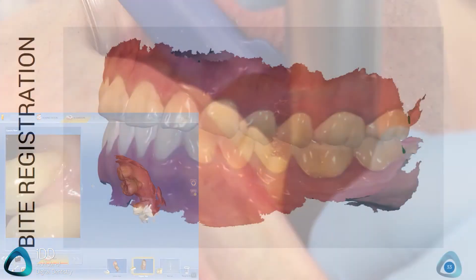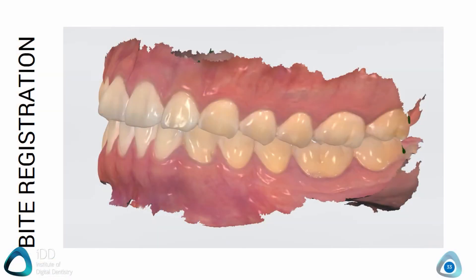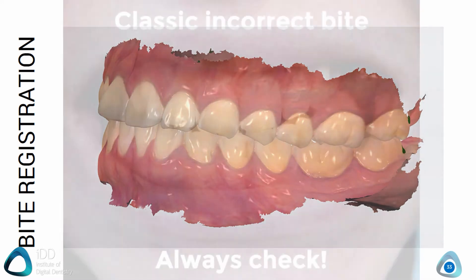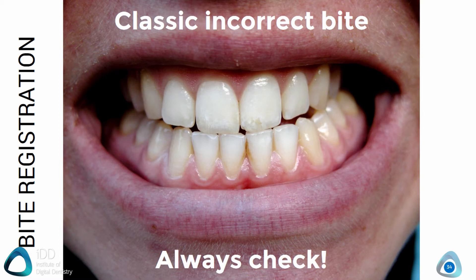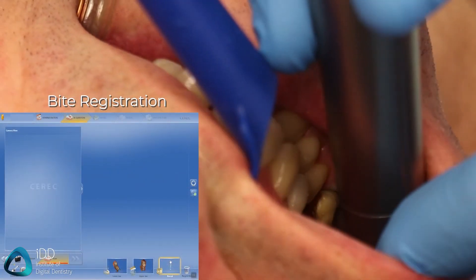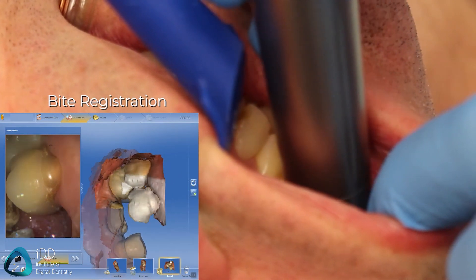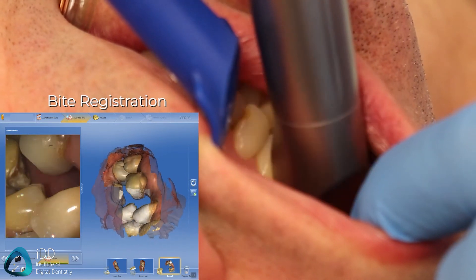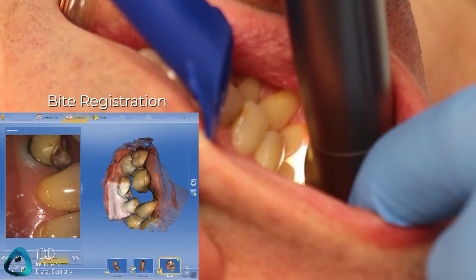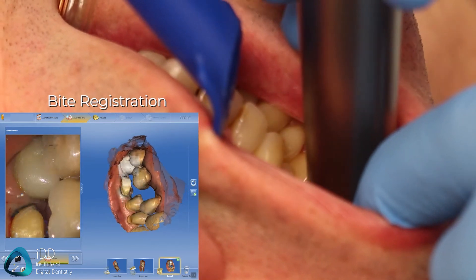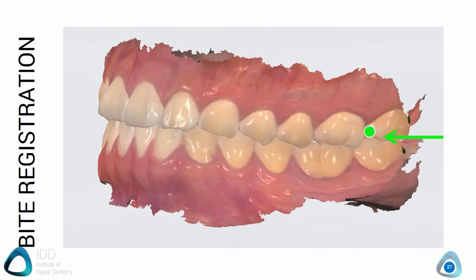The last part of the puzzle is the bite registration, which aligns the top and bottom scans. Make sure the patient is biting properly — this can be more difficult for patients that are numb. The easiest way is to tell them to bite hard on their back teeth. Once they are biting, tell the patient you will slide the scanner between their cheeks and not to worry or open their mouth. Once the patient is biting down, place the scanner as posteriorly as you can, facing the occlusal table.